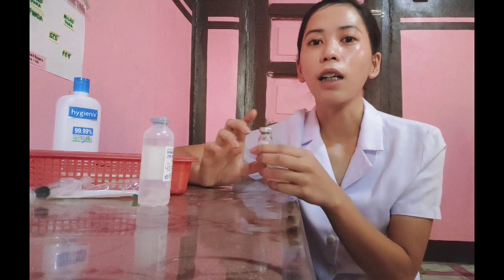The rationale is time is an important factor to consider in the expiration of this medication.